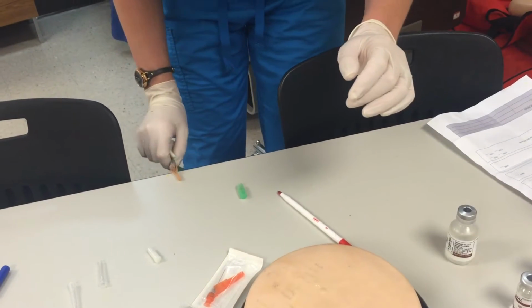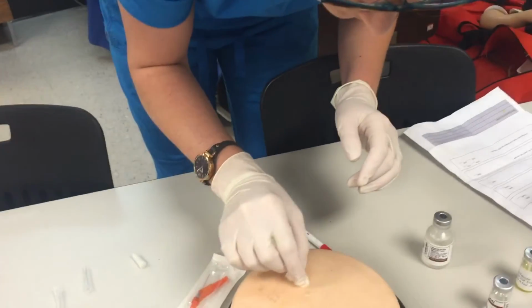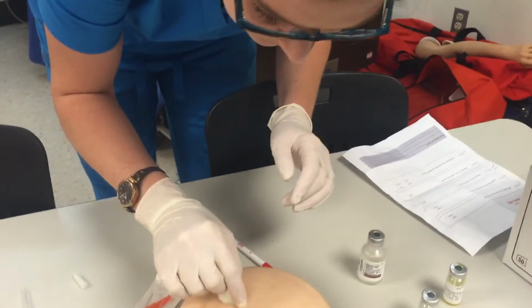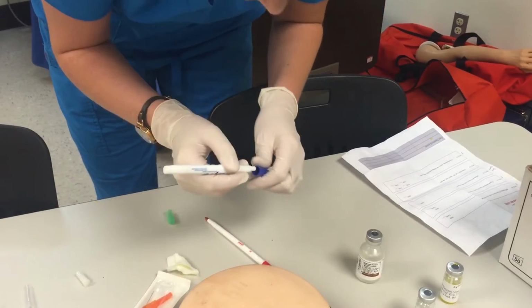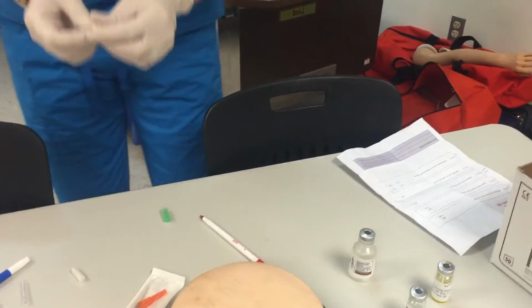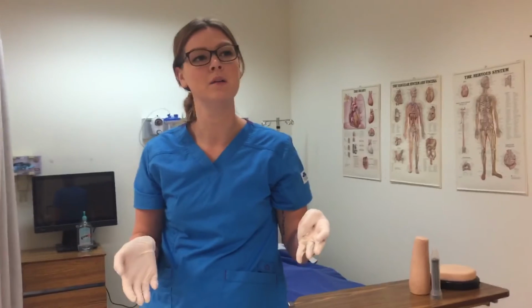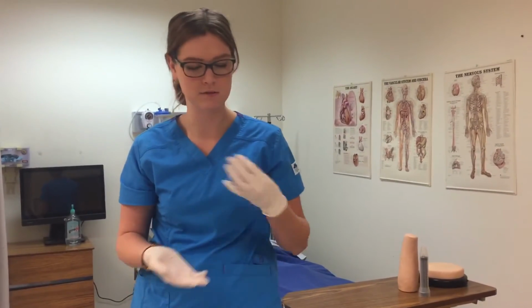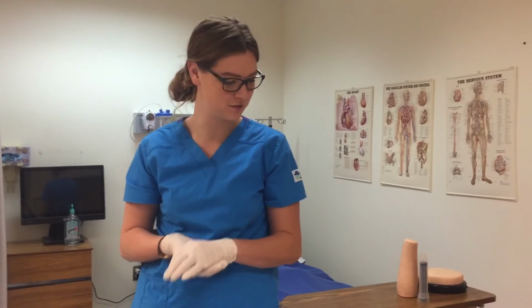Put the safety on, dispose of it, clean it, being really careful because you don't want that bleb to go away. I would mark my bleb with a skin marker, so then whoever notes the bleb when the patient comes back knows the size to look for a reaction. I would again inform my patient that they cannot leave town. They have to come back within 48 to 72 hours to have this TB test read.